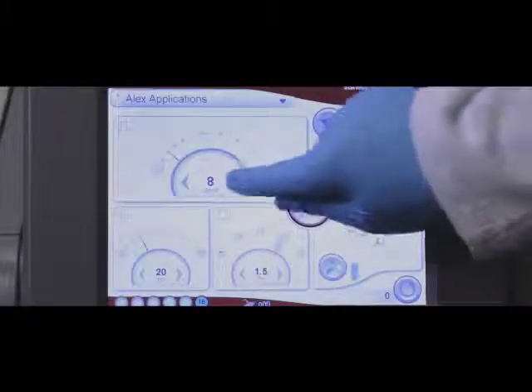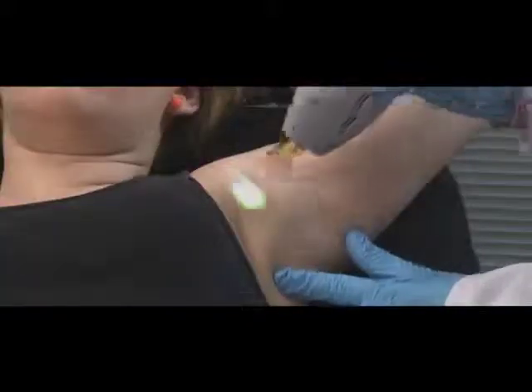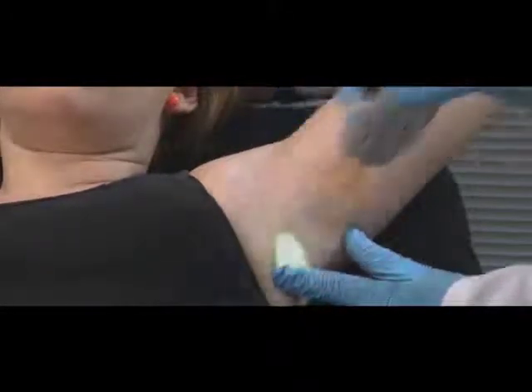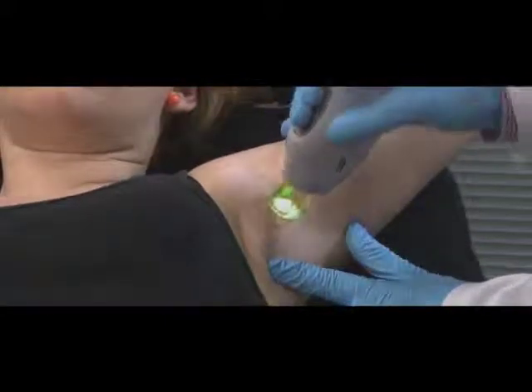Once the safety of the surroundings has been checked and the parameters have been selected, we will pulse the laser 1 or 2 times in each of the selected energies, and then wait for the skin's response. We look for parafollicular edema in the case of the 755 nanometer laser, which may be accompanied by a mild redness.